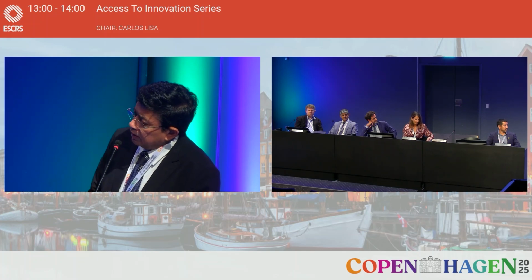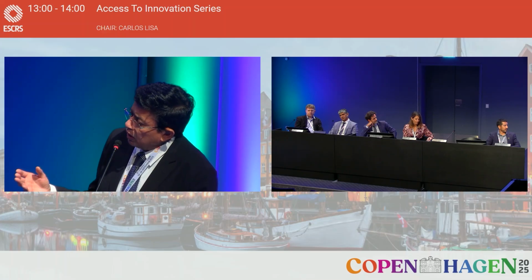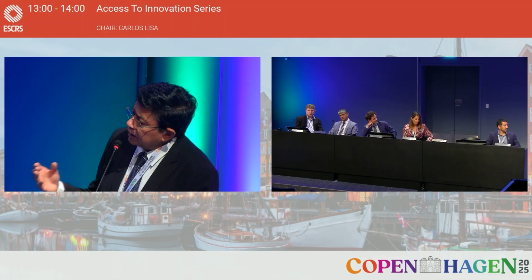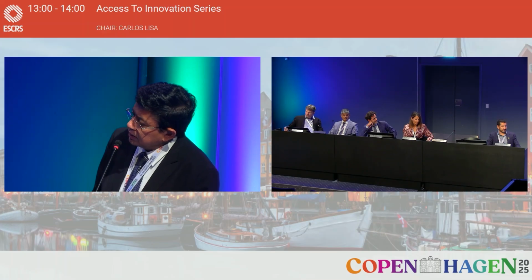On the other hand, if you go for the currently available EDOFs, then for these patients the quality of vision is reasonably good. At least with some of them, it's as good as a monofocal intraocular lens. But as far as the quantity of vision is concerned, with near vision, it's N10, N8, they invariably required +1, +1.5 diopters as far as near vision is concerned.